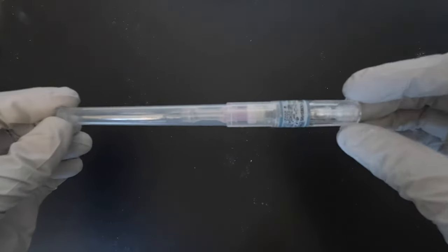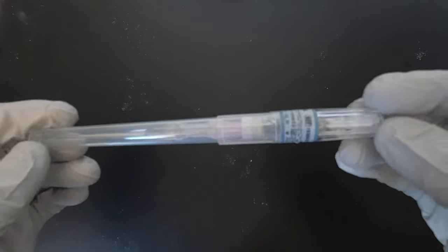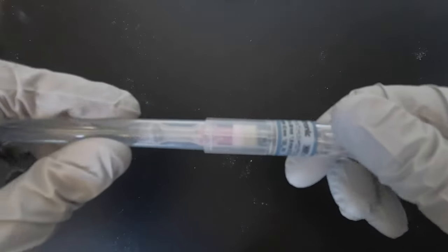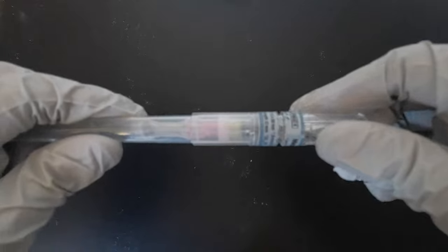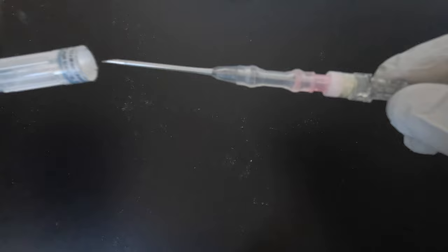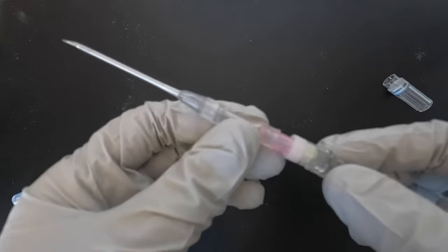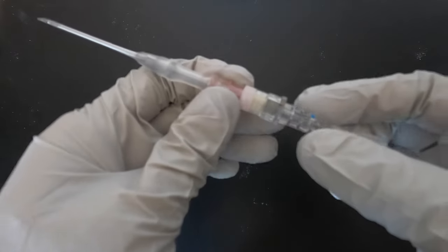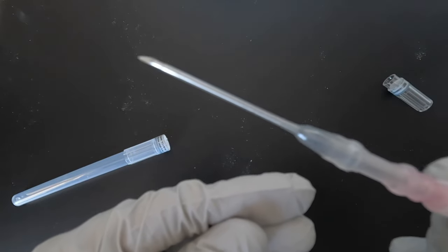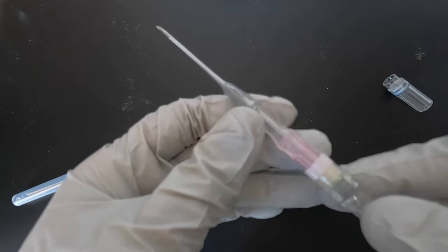For the needle without the anti-reflux valve, it comes in packaging where the sticker should be sealed. When you open it, just twist it off. This is the cap, and this is the needle. It basically looks just like your IV cannula needles. This is the sharp part.